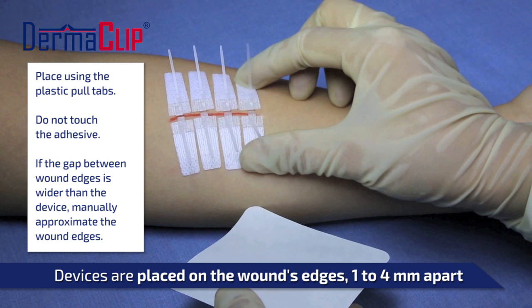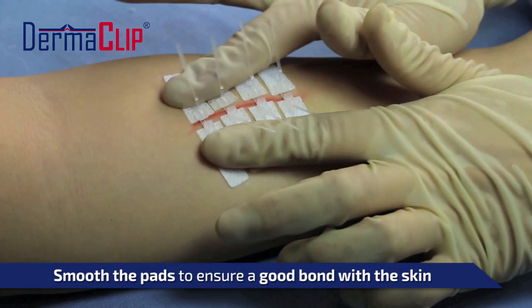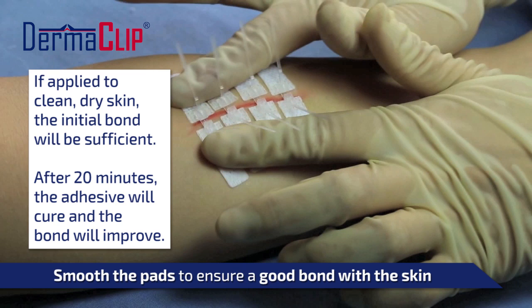If multiple Dermaclip devices are needed, space them one to four millimeters apart. Once all devices have been placed, manually smooth the adhesive pads against the skin to ensure a good bond.